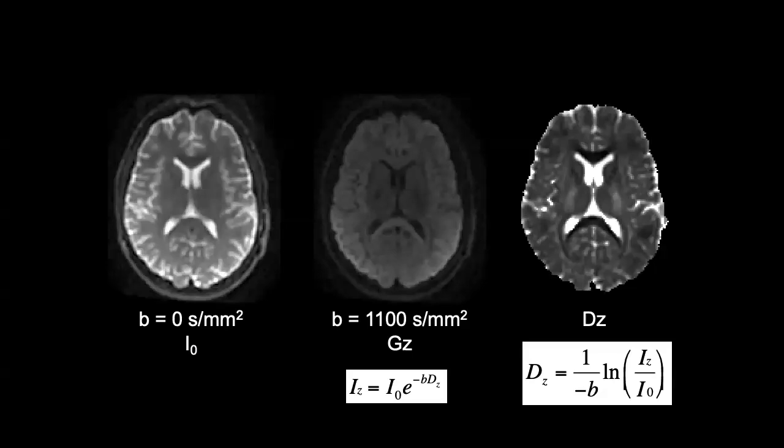Okay, so that's all the phantoms for now. Now let's look at some brains, which is what we all, I'm sure, love to look at. So now we can do the same thing in a brain image. So now you've got the b0 image, the non-diffusion weighted image. And it looks like a T2 contrast because of that TE and TR. And it's, again, collected with EPI. And then if we add diffusion weighting, here we have put it on in the Z axis, so that's like in and out of the plane.